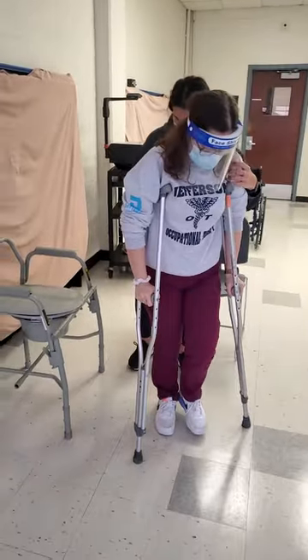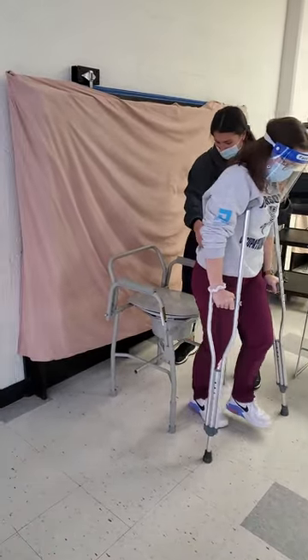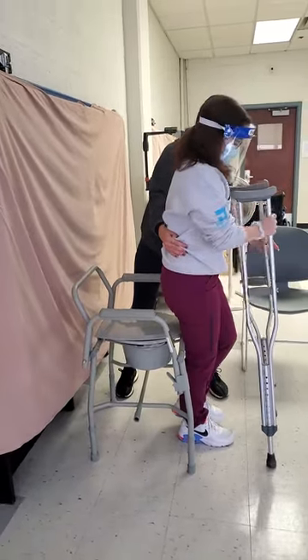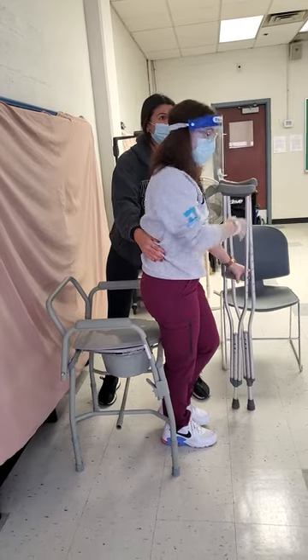We're going to do this one, and we're going to back up — just turning and backing up. Wait until you feel the chair on the back of your legs. Do you feel it? Okay, and then on the count of three — first I'm going to have you put these on your long arm.